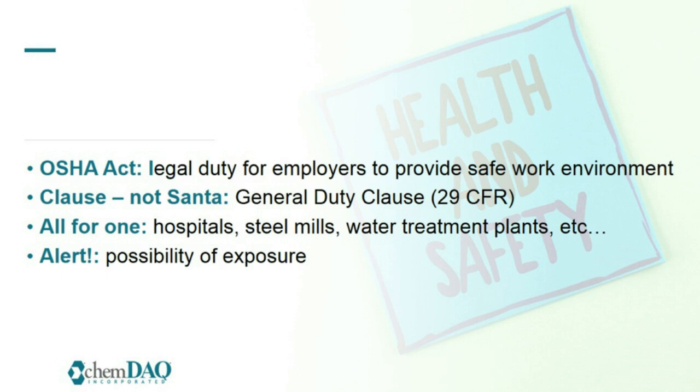It makes me think of a time not so long ago when I was managing a department. We had an area monitoring system, and in my sterile processing department that was located in the basement, we had an ethylene oxide sterilizer, and we in fact had a leak. And my alarm started going off, so my staff called me. We evacuated the department.